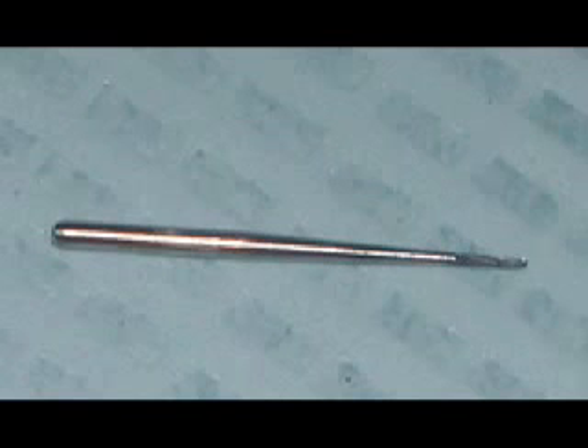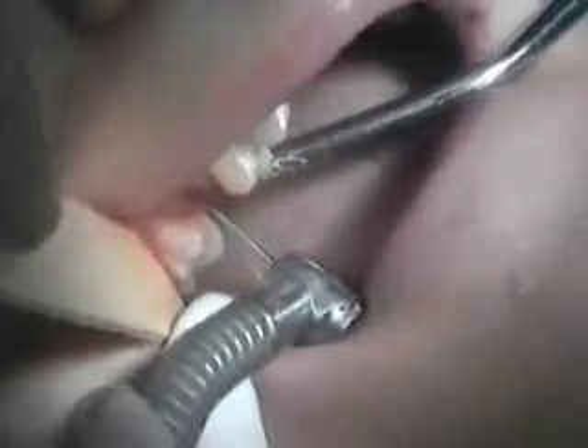The next step is to do a figure-eight motion and pull down and remove. You can see the two roots. Now, of course, the high point is in the middle, and we need to be able to get to that.